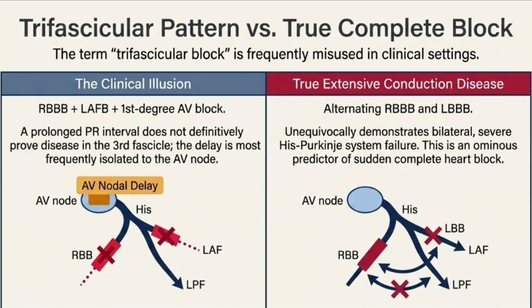Exactly. Dr. Asufle actually brought up a pretty scary rule of thumb regarding this called the syncope rule. Now, syncope is just the formal medical term for fainting or passing out, right? So the rule states that any bifascicular block on an ECG paired with a patient who reports fainting equals, and I quote, intermittent complete heart block until proven otherwise. Yeah. If you are evaluating a patient, this is a blaring red siren. Think about the physical mechanism of fainting. The brain briefly stopped receiving enough oxygenated blood.